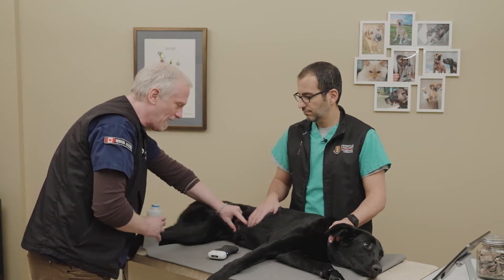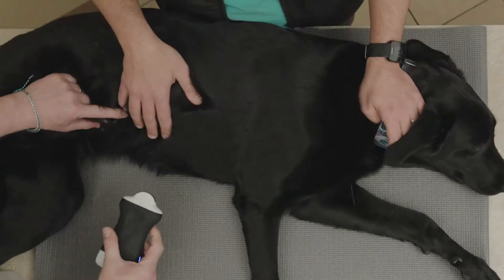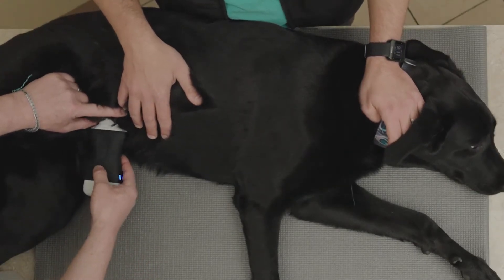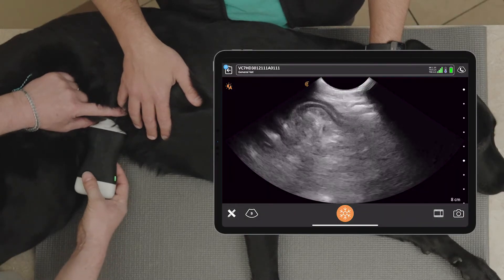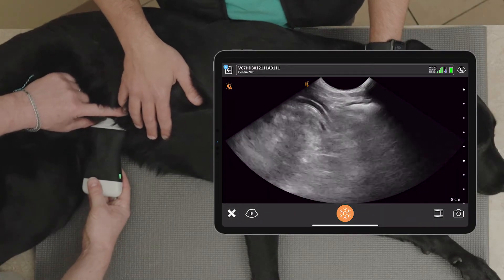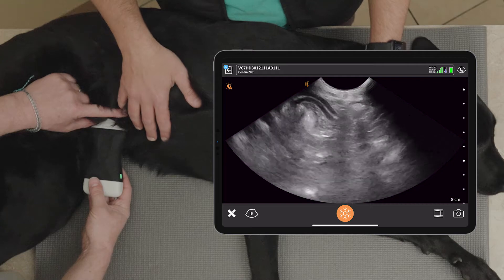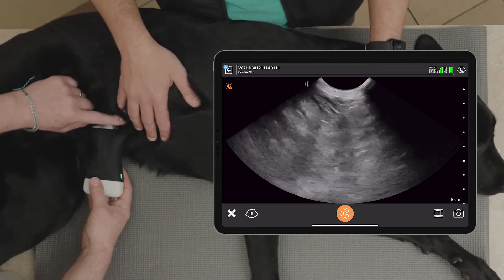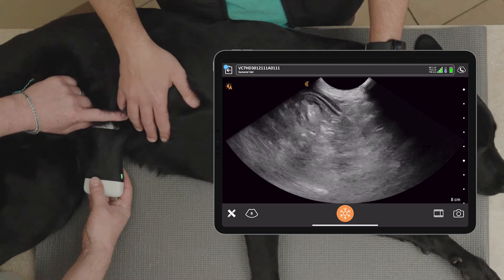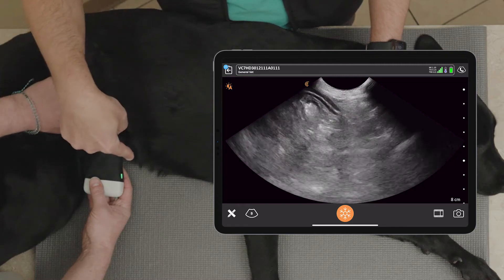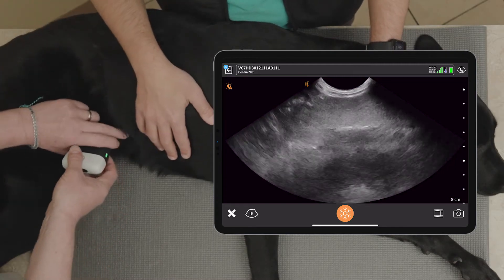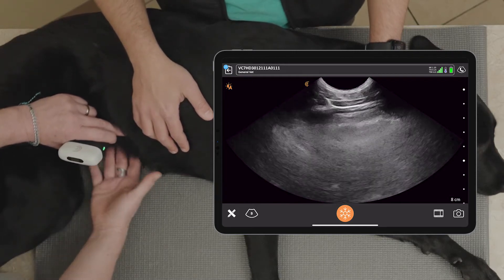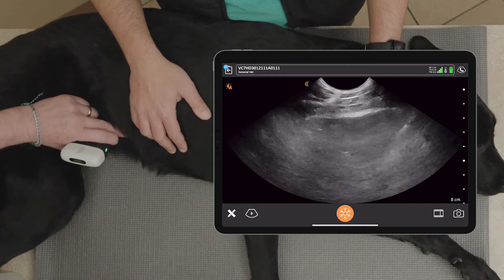We apply alcohol after we've separated the fur. We'll start with the marker towards the head and come in at that umbilical site. When we come in on that umbilical site, if our patient is in a standing position, we're going to come in with the probe directed towards the spine, because that fluid is going to accumulate along the body wall. If our patient's in lateral, as we see now, and fluid is the question we want to answer, we've got to direct that probe down towards the tabletop — where my fingertips are here — so we pick up that fluid in the gravity-dependent region.